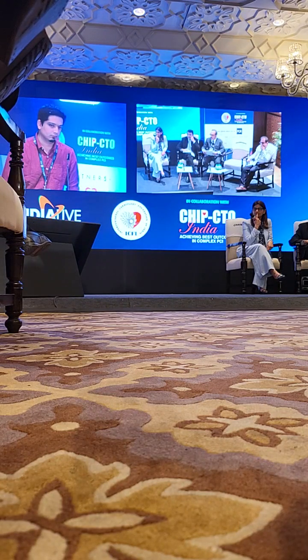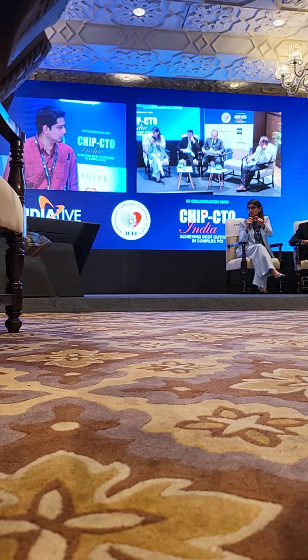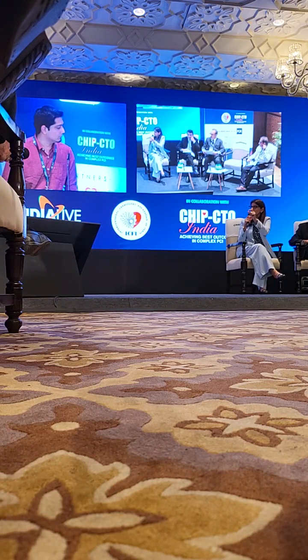The only problem with today's interventions is that we are very fast in the cases. We have to be very gentle. That's what I feel. One more point I want to add: while you are doing these left main cases, you have a bulky balloon, like a 4.5 or 5 millimeter balloon. When you deflate and want to take it into the guide, just wait. Let it deflate properly and then take it out.